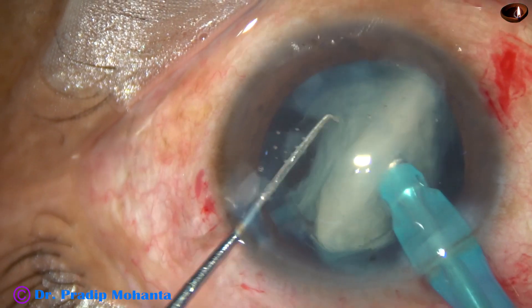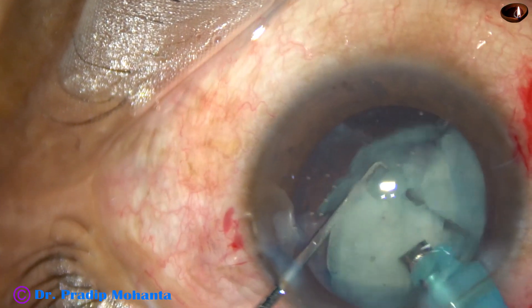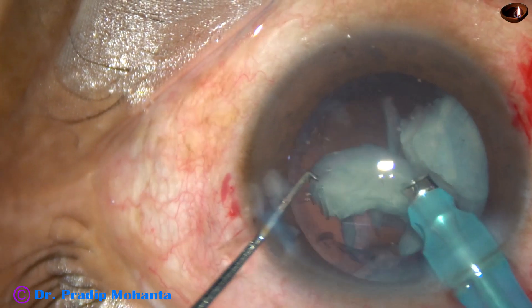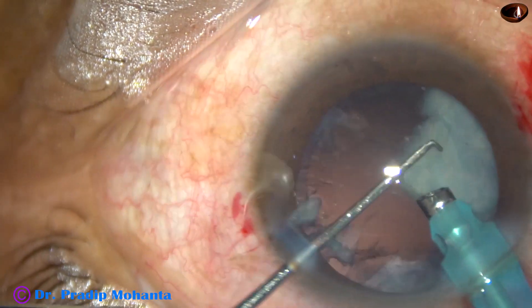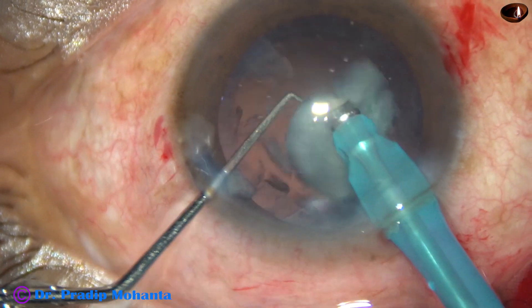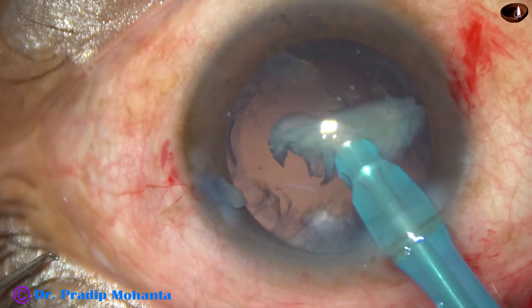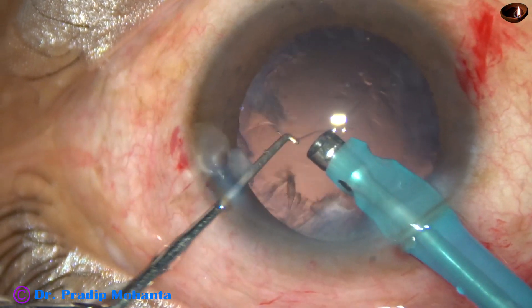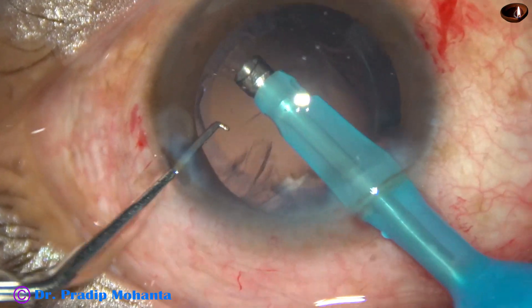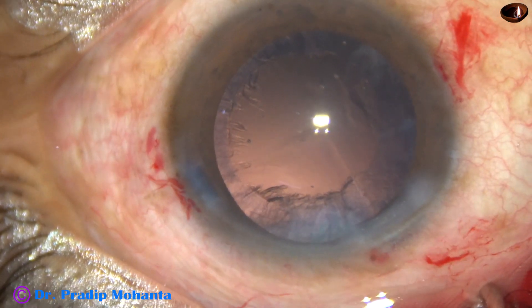So tilt the nucleus and start eating it up. When the nucleus is very soft, you can just rotate it several times, tilt the nucleus and start eating it up. This is the last nuclear fragment. Phaco power used in this case is 50%, flow rate is 40 ml per minute, and vacuum is 350 mmHg. This is early cataract-style emulsification.